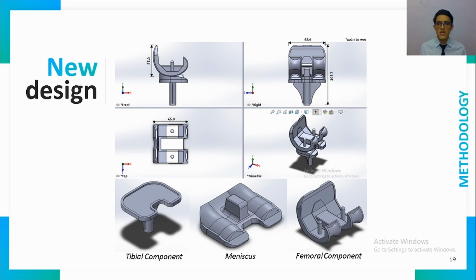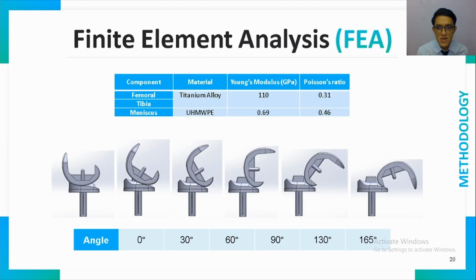A new design was created using SolidWorks, applying the solutions for a new concept of the high-flexion total knee replacement. A new design concept using a femoral and meniscus structure that have space for a stopper at the maximum angle of flexion. A convex meniscus with a double enveloping femoral condylar contact surface is designed using SolidWorks as shown in the following figures.